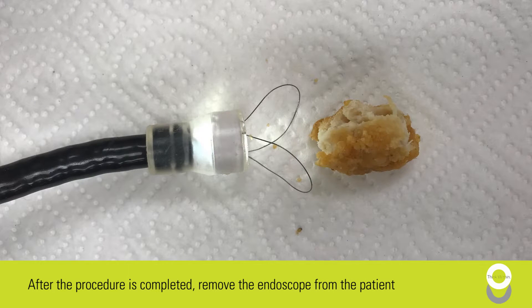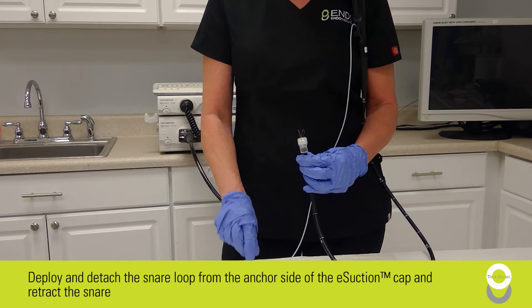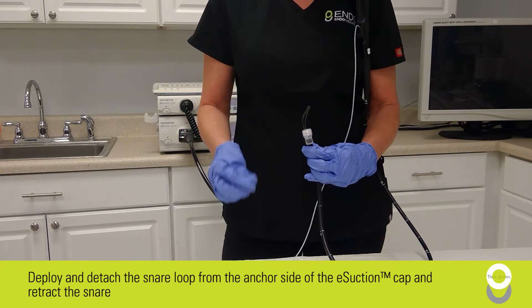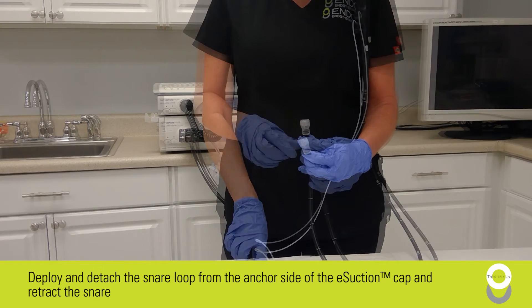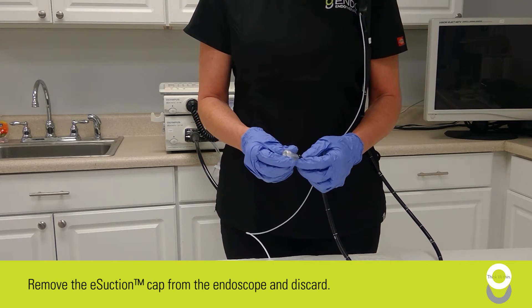After the procedure is completed, remove the endoscope from the patient. Deploy and detach the snare loop from the anchor side of the e-section cap and retract the snare. Finally, remove the e-section cap from the endoscope and discard.